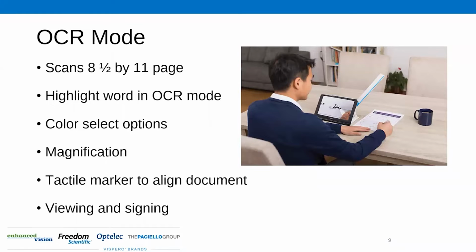So again, this device will detect the mode that you're trying to use, or will make a best effort based on the fact that if you extend or retract the stand, whether you extend or retract the extended arm, it will figure out what you're trying to do, and it will automatically select the right camera. Thus removing any UI barriers or technology barriers, for that matter, particularly if we're trying to serve someone who's senior, who may never have experienced a smartphone, may not get on with touchscreen, and that's why we have the on-screen controls that I know you're going to demo a little later.